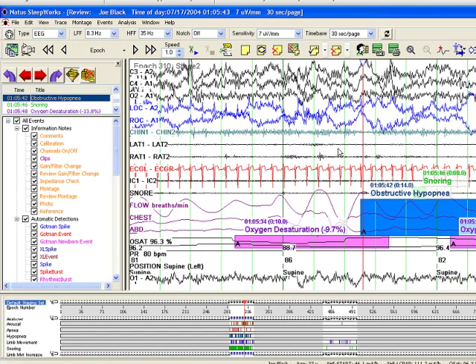So to achieve the best results, it's best to have your analyzer set to always. Lights off will work too, just as long as when you click on lights off, that occurs while the patient is still in awake stage. Again, that's because the analyzer is expecting to compute some baselines when the patient is awake, and they're expecting this to occur at the very beginning of a nap.